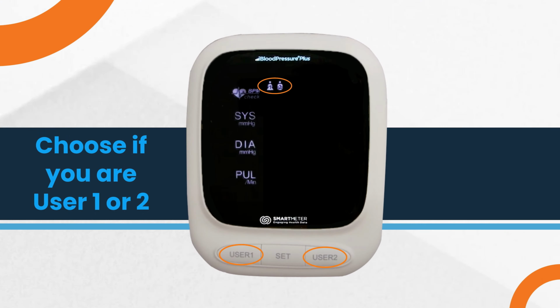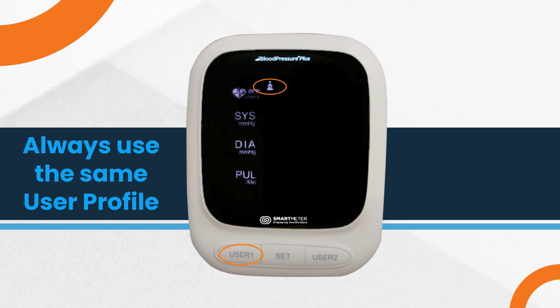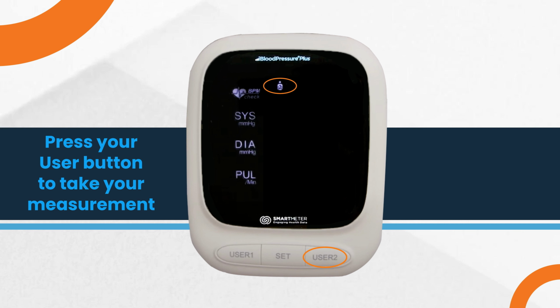Before taking your first reading, decide if you are user 1 or user 2. It's important to always use the same user button for consistency, as each button keeps track of your testing history in the device's memory. Going forward, pressing your assigned user button will turn on the device, take the measurement, and send the results to your healthcare provider or care team automatically.